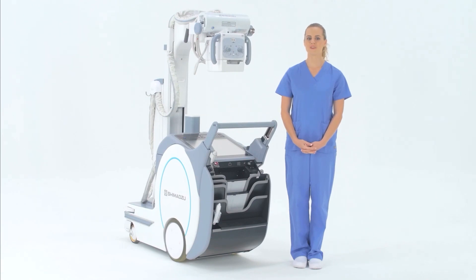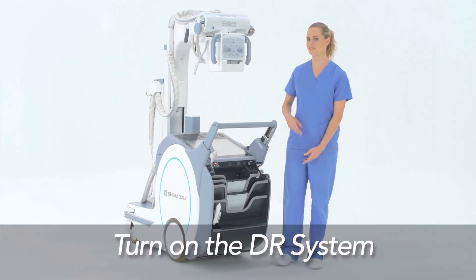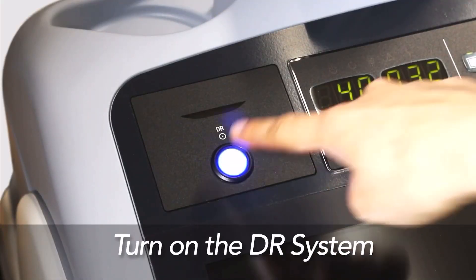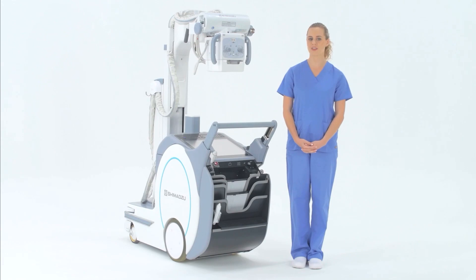The touch panel monitor for the digital radiographic system is located on the base. Turn on the DR system by pressing the large blue button to the top left of the display screen. Then turn on the DR panel by pushing the power button located on the side.